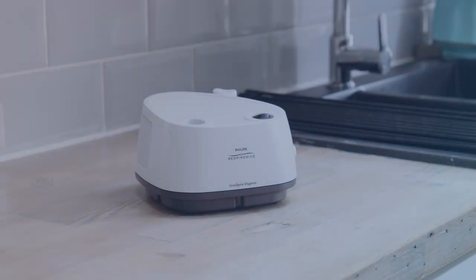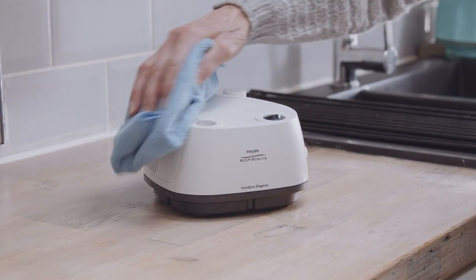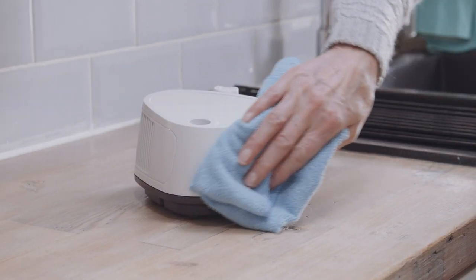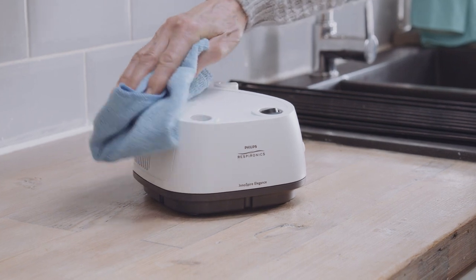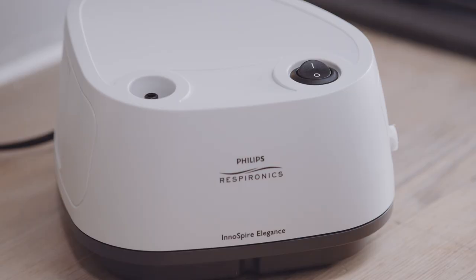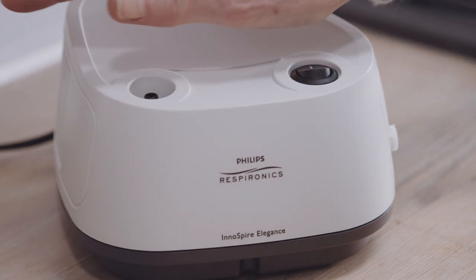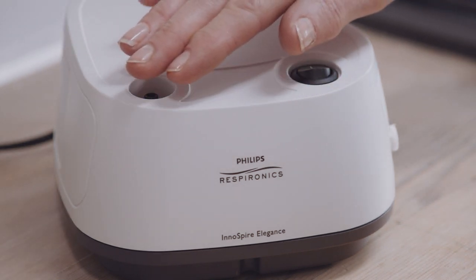Always unplug the unit before cleaning. The device can be cleaned by wiping down the outside of the compressor with a clean damp cloth — do this at least once a month. After cleaning, make sure the unit is working properly by checking that air still comes out of the nozzle when the unit is turned to the on position.